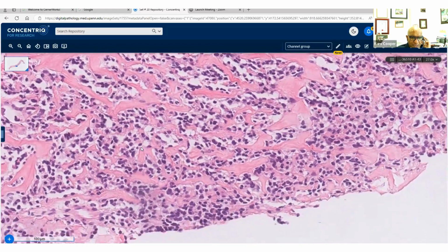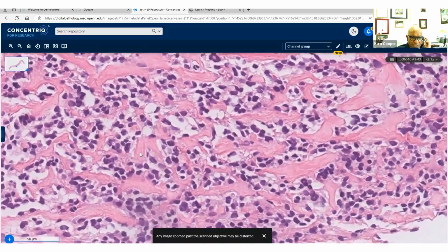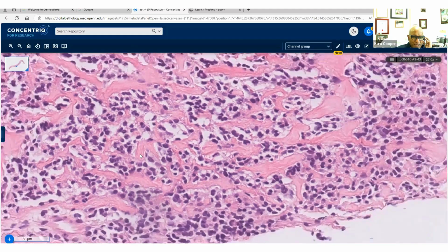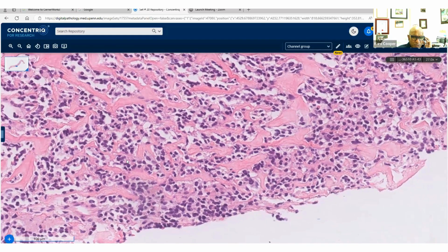Given that we ruled out smooth muscle tumor with negative desmin and caldesmon, and more importantly, negative caldesmon with positive actin, you're correct, the melanocytic markers did come up positive. So this in fact is a PEComa. It had Melan-A, patchy and focal, and some HMB45 as well. The current approach would be to give some form of risk stratification. How is this PEComa going to behave?